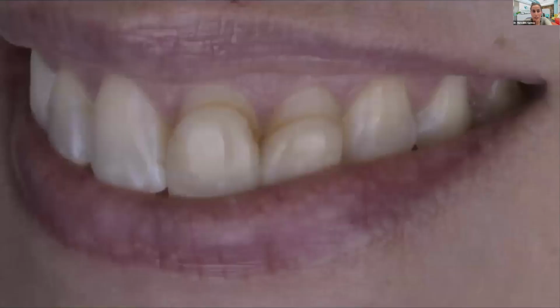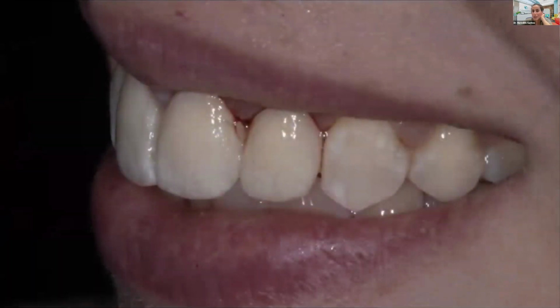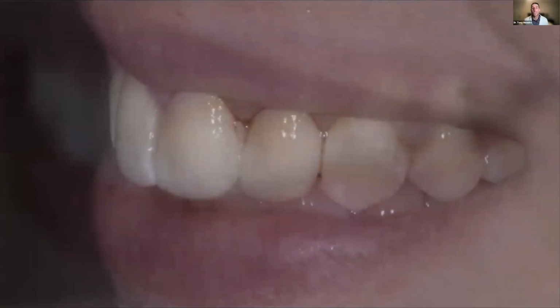So Miss Renee starts like this. And when Miss Renee is leaving, these are her 3D printed temps. And you can see they're fresh. I've still got blood in there from cleaning up my cement. But that's what that looks like. And so we've got her in a much better state that now we can phase that treatment. She can tell people I'm her dentist, and Renee is going to feel much more confident on a budget.